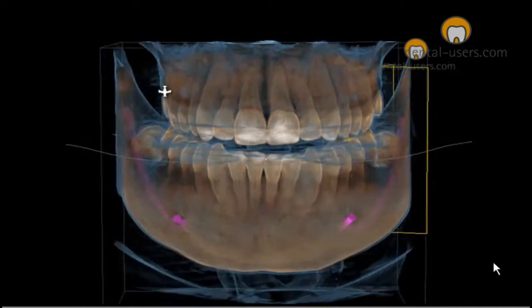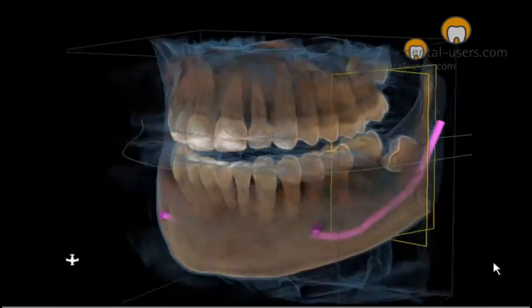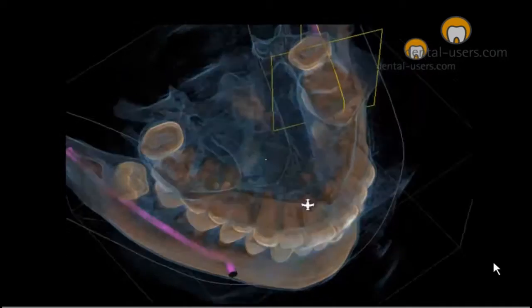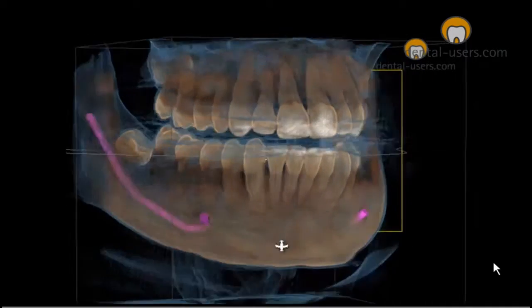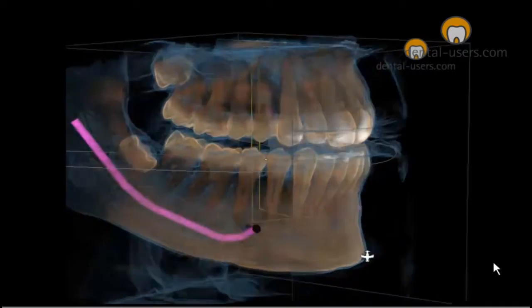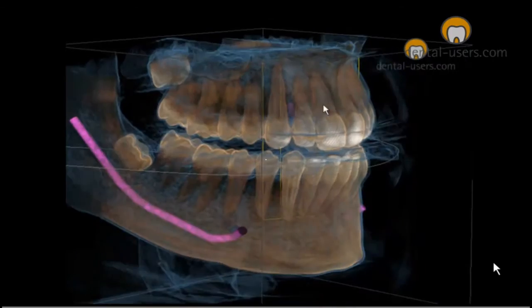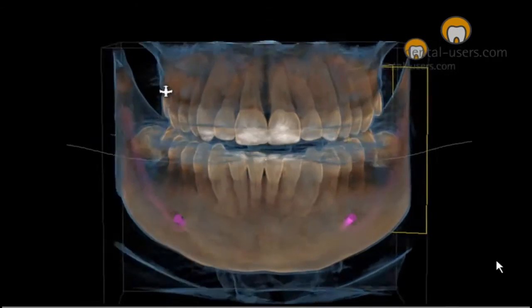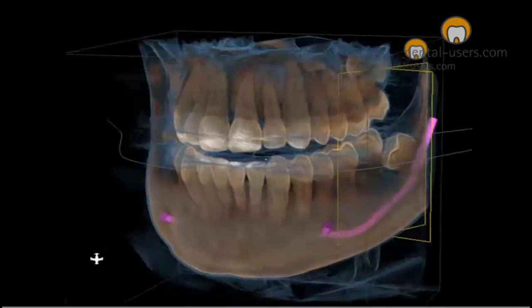In this case we have a young patient who came to our practice to have her wisdom teeth extracted. We prepared a digital volume tomography with an Orthophos XG3D, 8cm field of view.